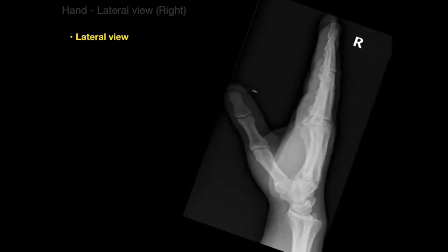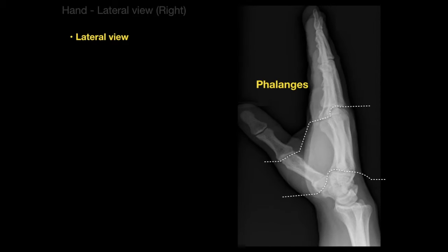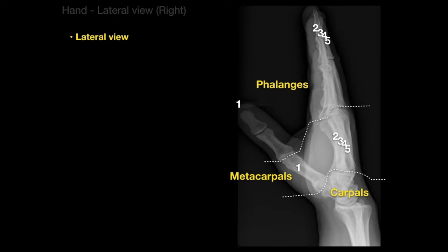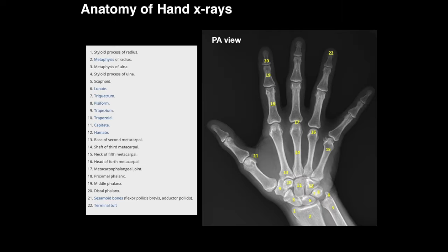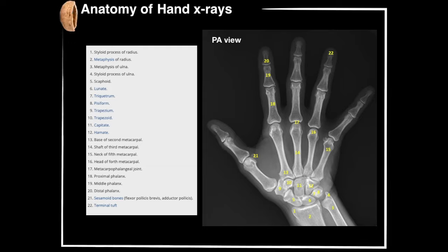The lateral view of the right hand shows the phalanges: digit one is the thumb, and the other four are all overlapped. The benefit of the lateral projection, which is 90 degrees to the PA view, is that you can see if there's fracture displacement in the carpal bones. It's also useful when a foreign body is sticking through the hand, as it's easier to see on this view. And there is the radius and ulna. That, my friends, is the anatomy of hand x-rays in a nutshell.